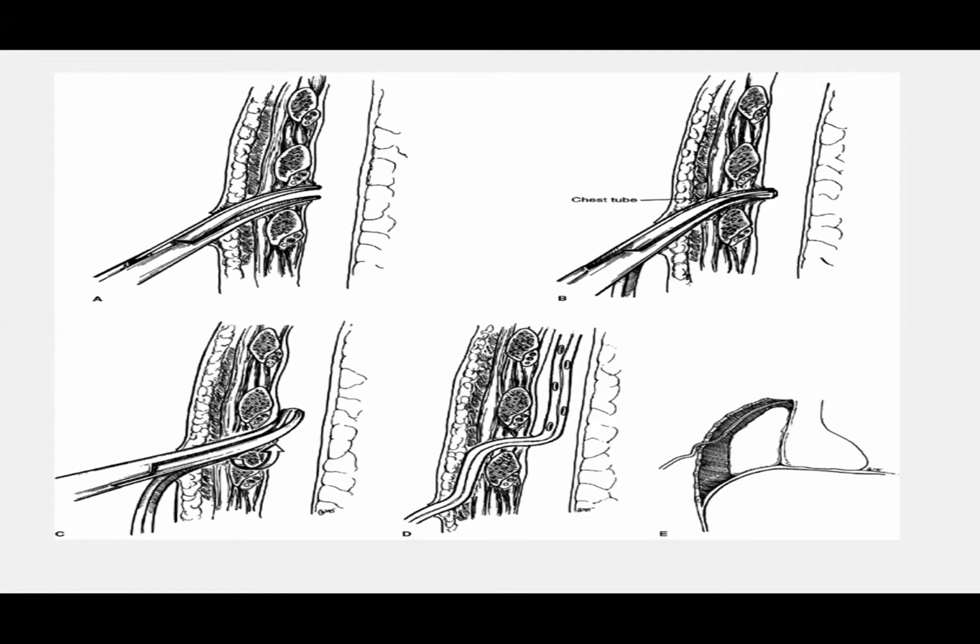So basically you are going to do your purse string around the chest tube, and then after that you are going to wrap the suture itself. Usually we use Ethibond number 2, so you wrap it around the chest tube, okay, until you are satisfied that you have wrapped the tube well with the suture itself, with the stitch. So after that, then you will do at the end one surgical knot.